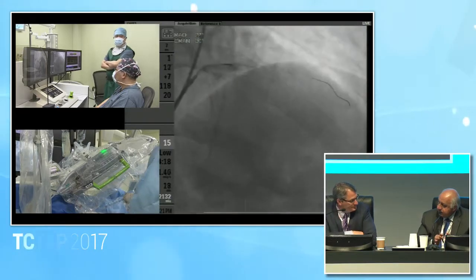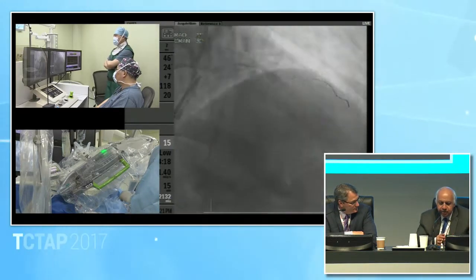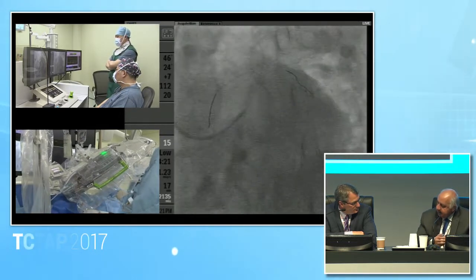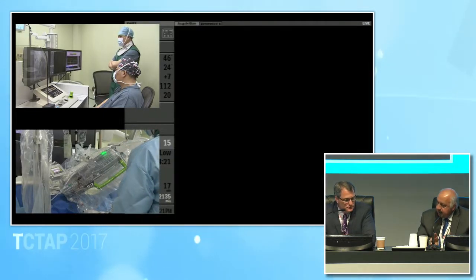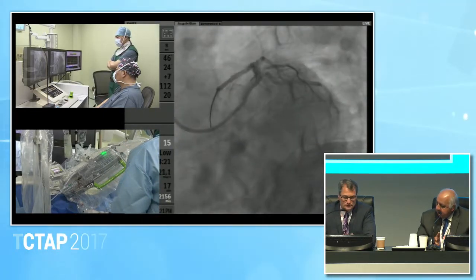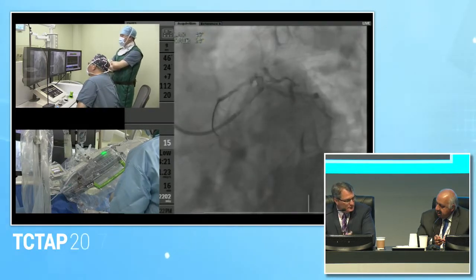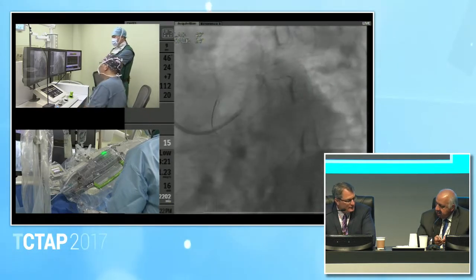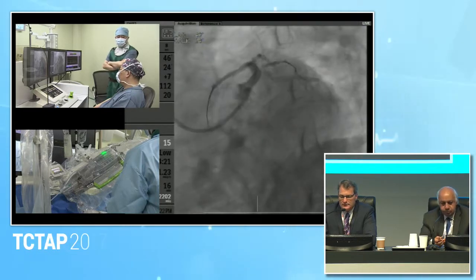Or just for the fun? For the patient, is there a special indication? I mean, is this artery for robotics, or two arteries for robotics? You said that CTO is not indicated, but otherwise it's indicated for any vessel? Yeah, if any case you can do without over-the-wire equipment can be done robotically. So I'd say 85% of the cases you currently do probably would be an applicable device.